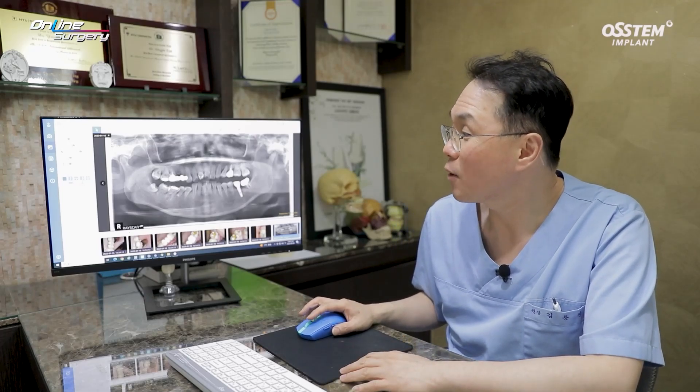For No. 6, a 7 mm implant was planned, and for No. 7, a 6 mm implant was planned. When planning short implant placement, the 4,8,5 kit can be very useful. When you're removing a wisdom tooth and you open the flap, the cortical bone of the external oblique ridge can be exposed.